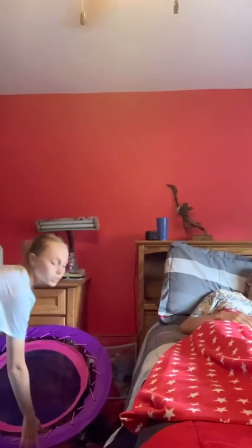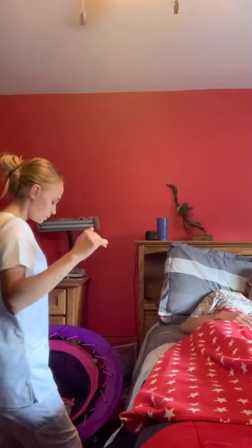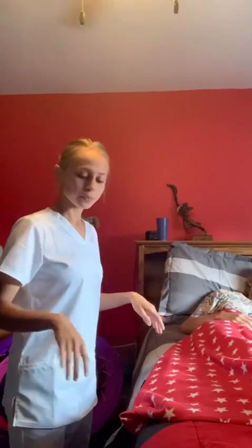So I'm just going to position the wheelchair up against the bed. The armrest is barely touching the bed. And now I'm just going to apply the seat cushion onto the wheelchair. Then I'm going to make sure that the wheelchair wheels are locked. So they are locked. And now I am going to lower the bed to a comfortable, safe position. So I'm just lowering it, and now I'm just going to lock the bed wheels.